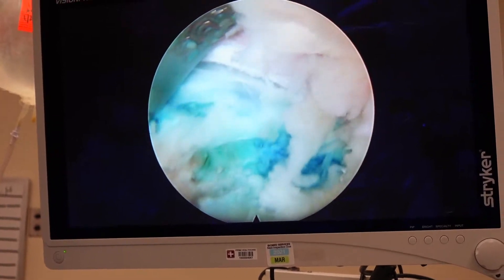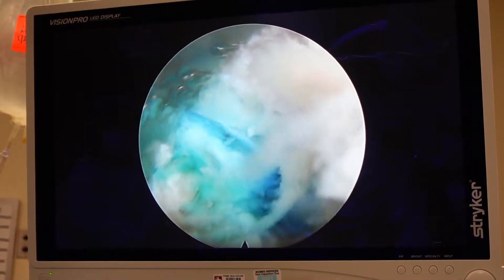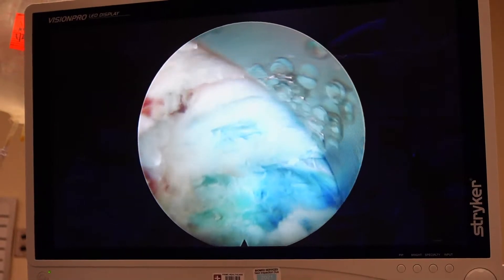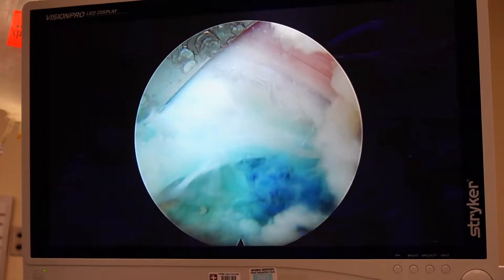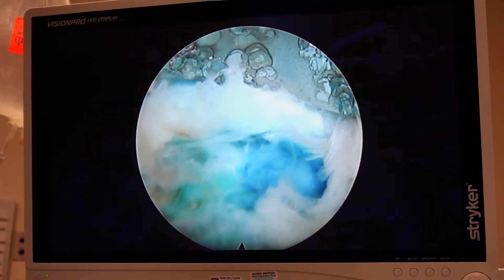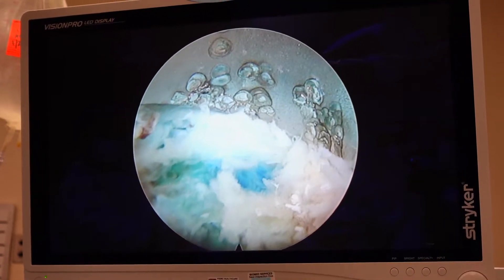I better be careful. You can see it's a little pinkish. Sometimes everything looks like a nerve, and in my mind everything is a nerve until proven otherwise. I thought I saw a nerve but I don't think it was — I think it was a band of ligamentum flavum. But it is right there because I am almost to the other side, so I basically need to get all this nucleus trapped inside the torn annulus locked out right there.